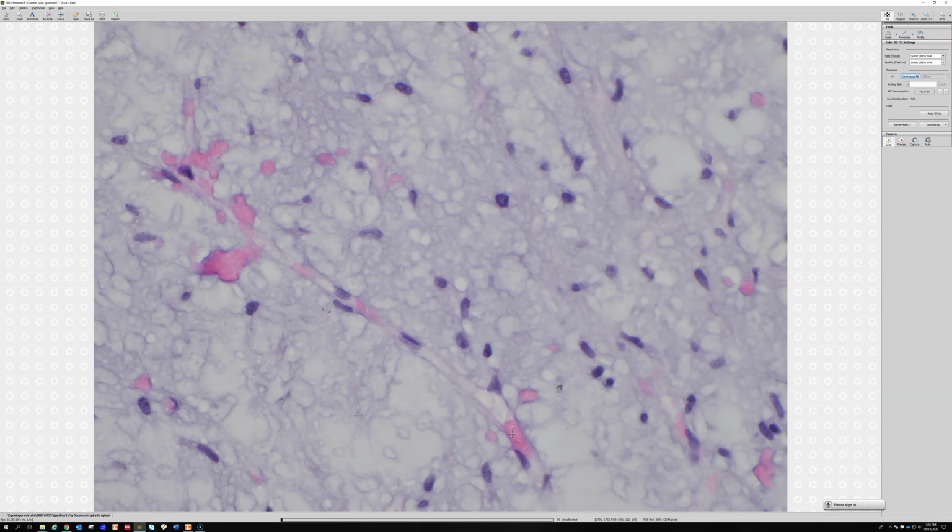So these delicate vessels that are one endothelial cell thick and kind of branch, these are the vessels of myxoid liposarcoma. And that's what this is. And this is a really important thing. I like the fact that when you think about this and you think, gosh, it looks benign, that is the pitfall of this tumor. Until you've seen one and recognized the pattern, you'd never look at this thing and think it's malignant.